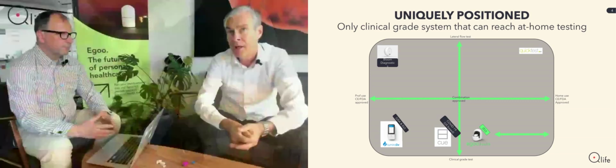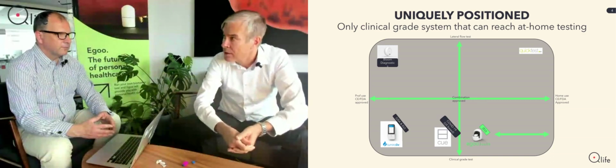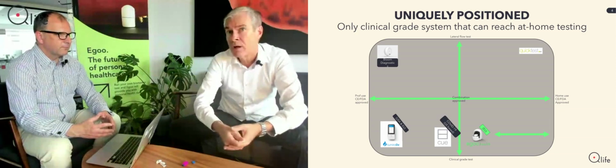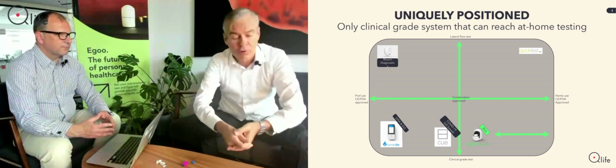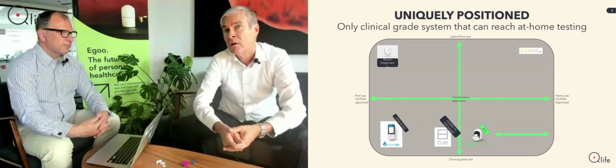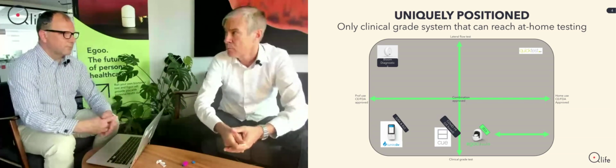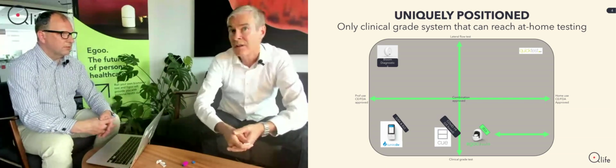That's not possible today. Today we have to send in the complete technical file, and then we have to wait for the notified bodies to approve it. And in practical terms, I can say that the difference now is that we have to use around 15,000 capsules as opposed to around 1,500. Oh wow! So basically 10 times more.